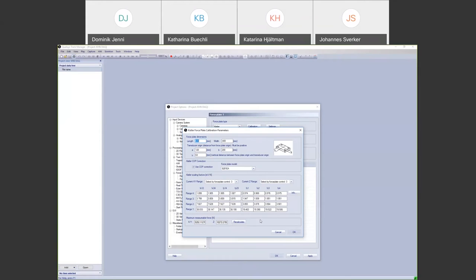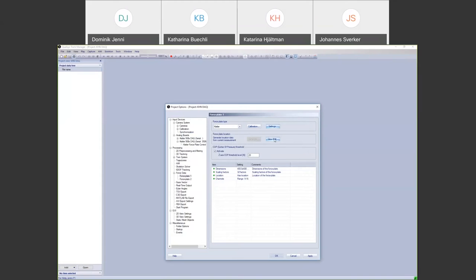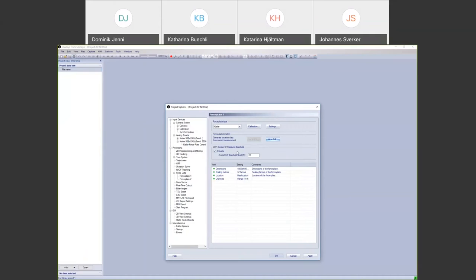You need to make sure the correct channels are assigned to the force plate. Finally, you need to specify a position for the force plate. This is most easily done by placing markers in the corners of the force plate and making a short measurement. This gives coordinate values for the force plate location in the calibrated 3D space, and once done, you will get force data in QTM.